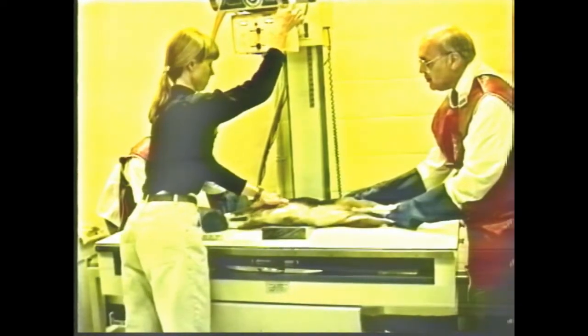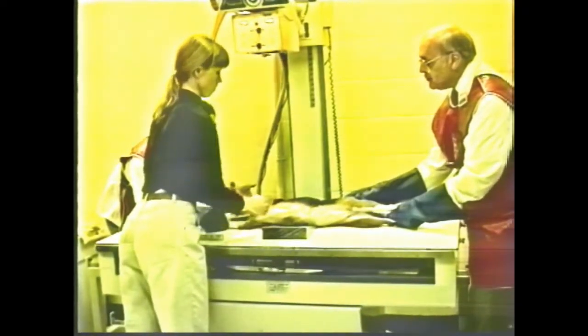The pelvis must be maintained lateral to control the caudal thoracic area. The sternum must be equidistant from the table as the spine. Therefore, the use of sponges is essential to create this truly lateral position of the thorax. The radiograph will be from the thoracic inlet to the last rib, and the beam is centered over the heart.